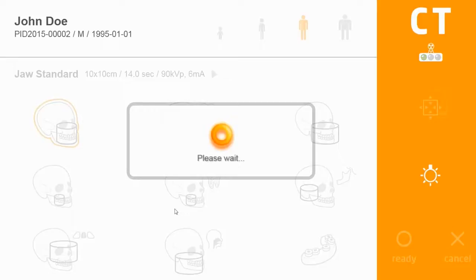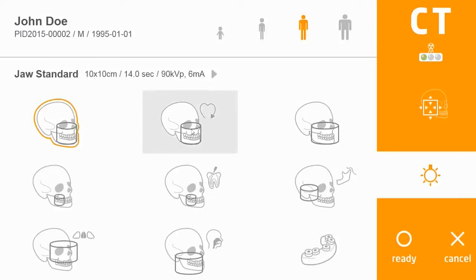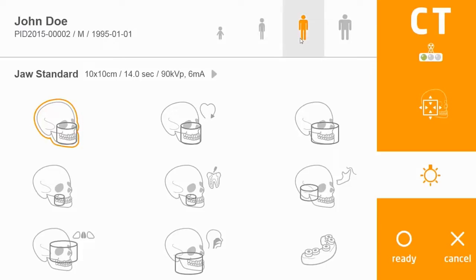Once you click OK, this will cause the machine to initialize and move to the home position, making it more convenient for the patient to enter the unit. In the top corner you can choose the patient size from a child to a small, medium, or large adult.